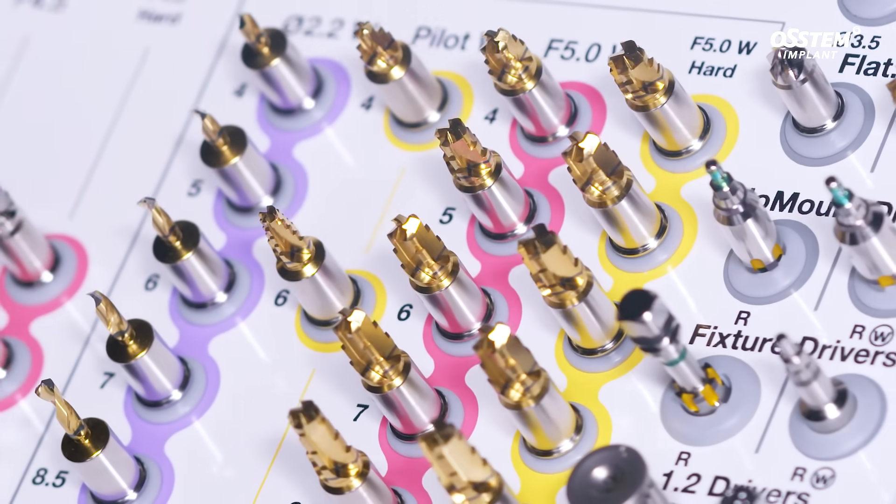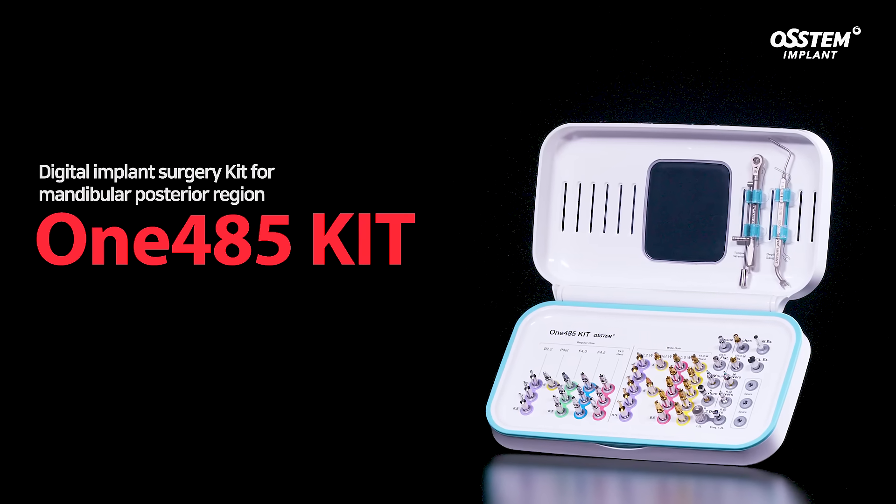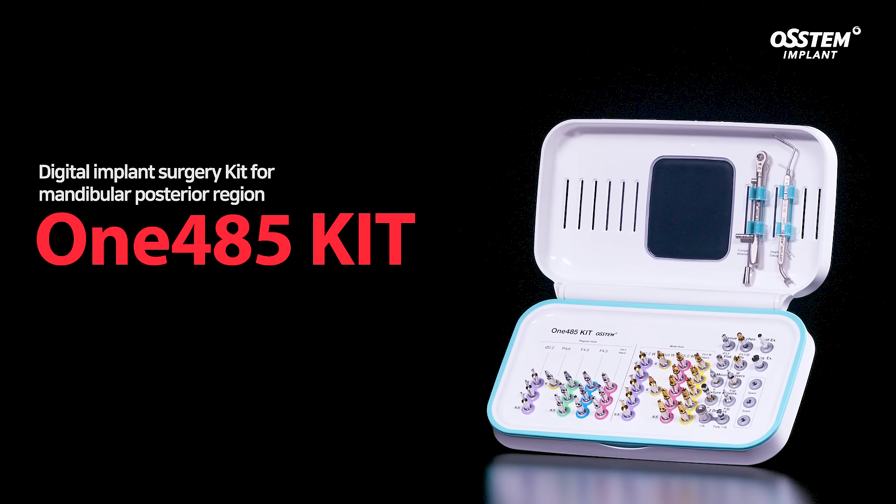Try the 1485 kit when you need to perform surgery in a mandibular posterior region.